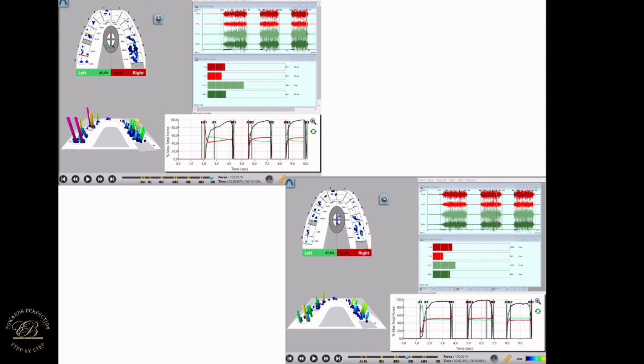If we took just the first bite, or the area where he closes 100%, and combine that with the after treatment, you will be able to see that the balance forces is now in the white area, which is more centered, and you will also appreciate that the muscle activity has fallen somewhat. The one that was really high before is not normal yet, but it has been reduced, so it looks a little bit more like its fellow muscle on the other side.